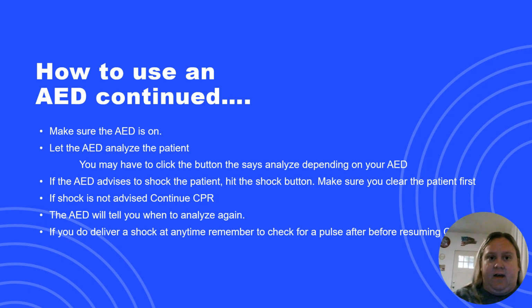When it is analyzing, it'll continue. So you'll analyze the patient, it'll deliver a shock or not deliver a shock. If it delivers a shock, you're going to remember to check a pulse, okay? Then you're going to go right back into CPR. And then it's like a revolving door. You're going to keep doing it until either you get ROSC, or call the patient.